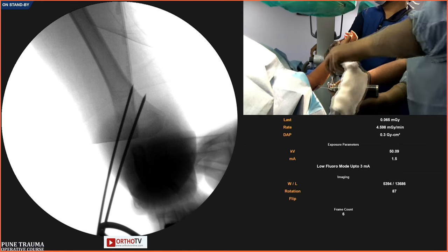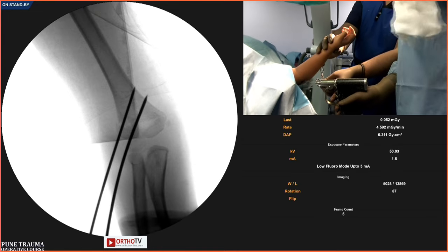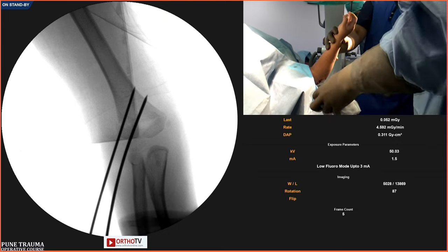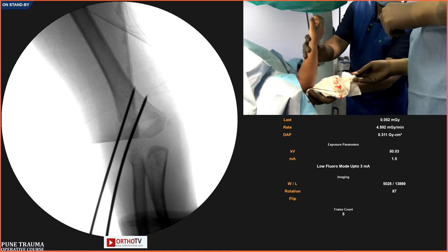Your assistant can extend the elbow. Can you see now? Yeah. It's still not clear. Now this is clear. Okay, so if you want, you can reposition the pins depending on your situation. And then finally we bend the pins and then we are going to cut.